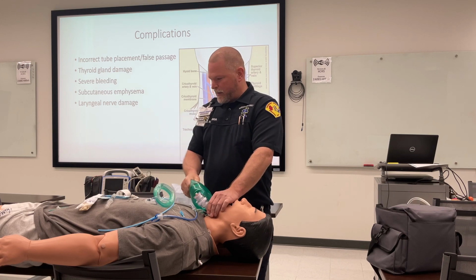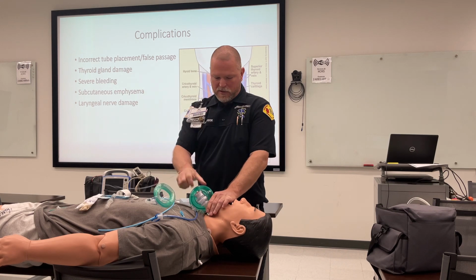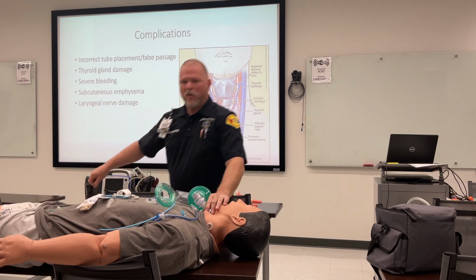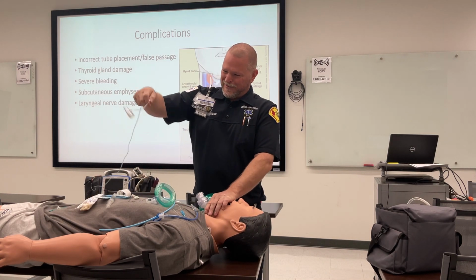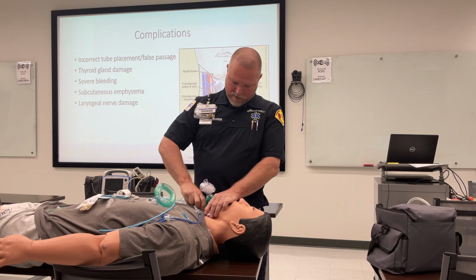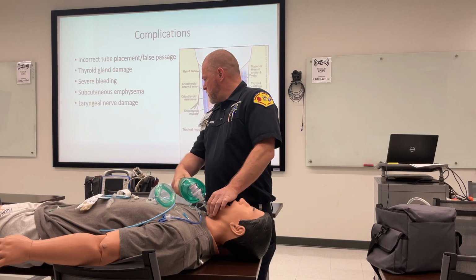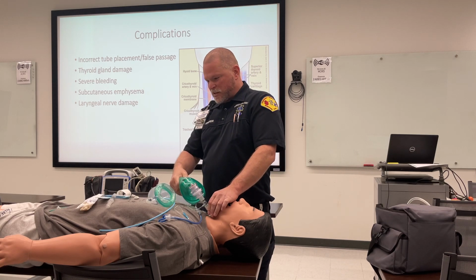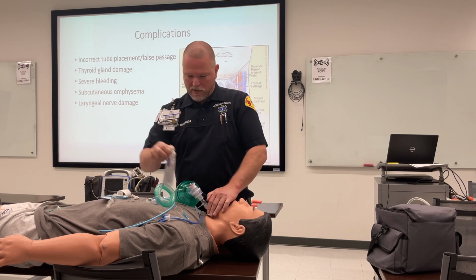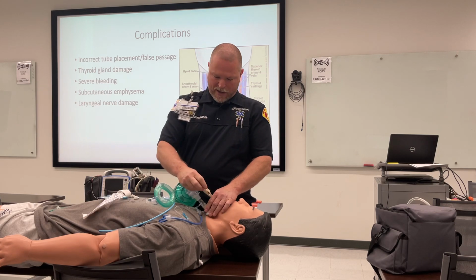I'm on a bag, and I've got my end tidal hooked up to my monitor. I'm gonna get my partner to help me out. But we're gonna get it all connected up. Check our readings on our monitor. Check our chest rise and fall. And then we got our secure device that I'm gonna have my partner put on while I'm bagging.